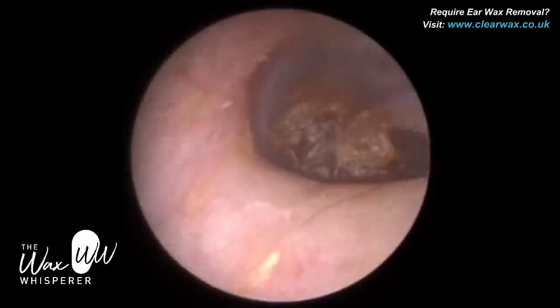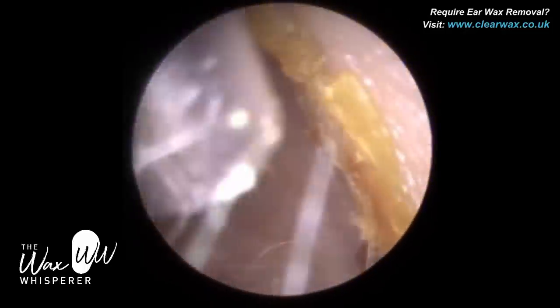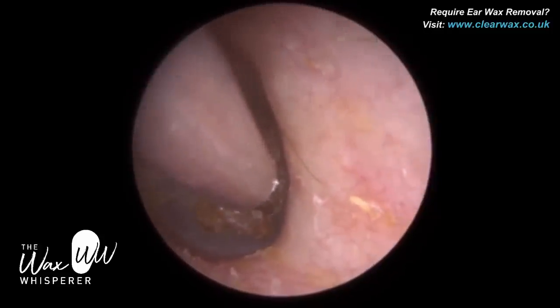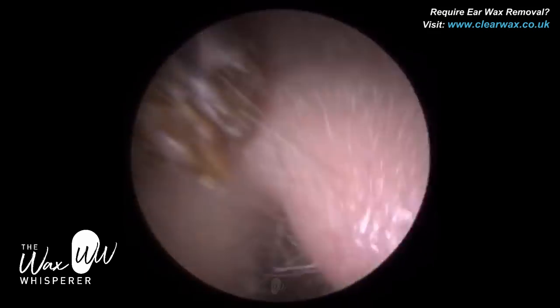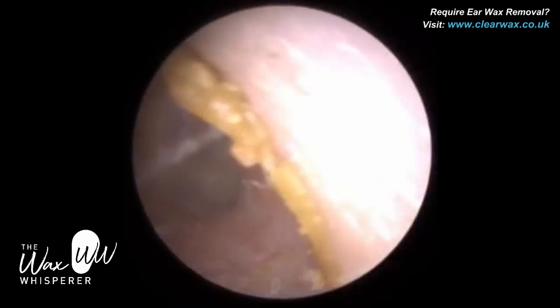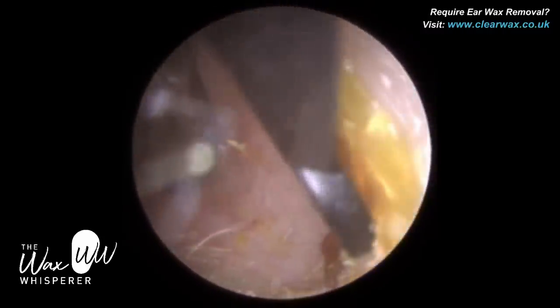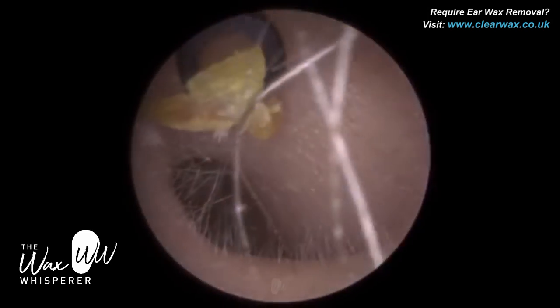In order to have binocular and stereoscopic depth perception, both eyes need to be able to see the object. In the ear, that's quite difficult because the ear canal is quite narrow. It's virtually impossible — unless someone's got a huge ear canal — for both eyes to look inside the ear canal at wax that's deep in the ear.